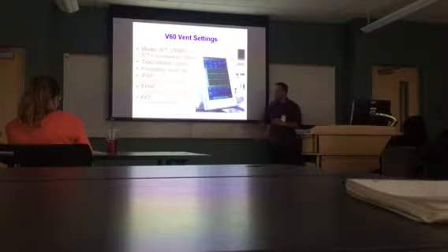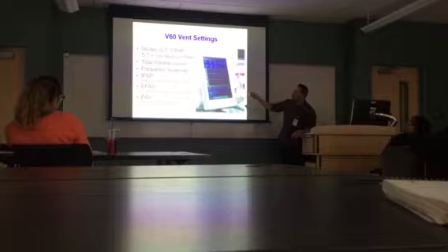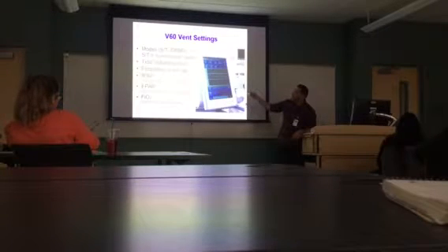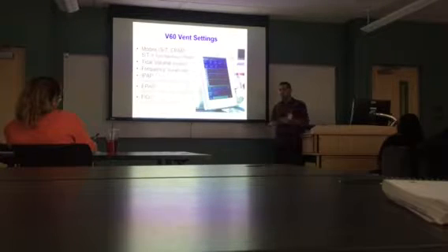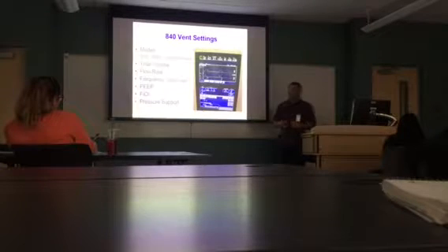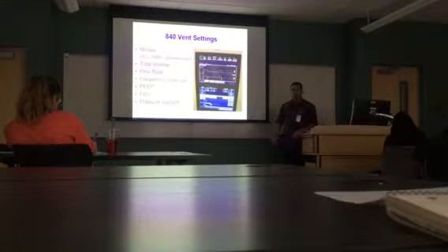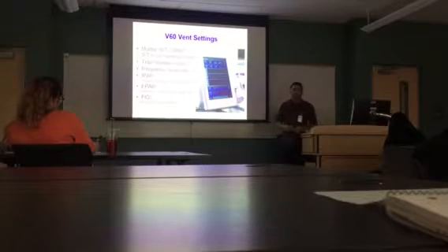All right, once you have them on that mask, there are 2 ways of ventilating them. One is ST, which stands for spontaneous time, and the other way is CPAP. Spontaneous time is the same as AC on the other one, if they were intubated. That is the person that you want to control, right? They're sick, so I want to give them more controlled breathing. Same thing here, you want to put them on ST.